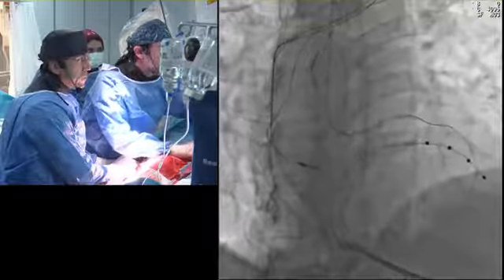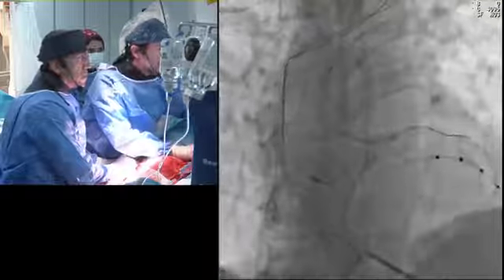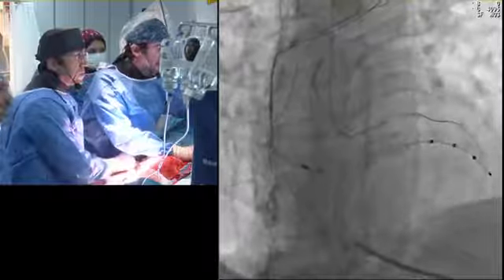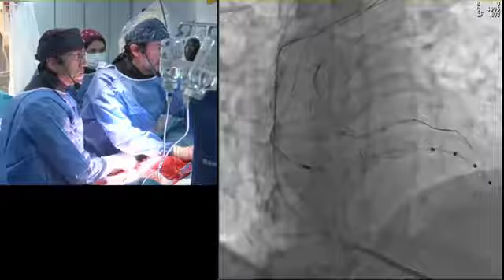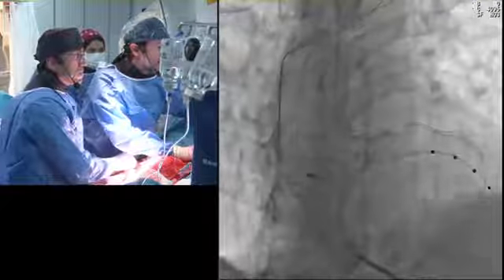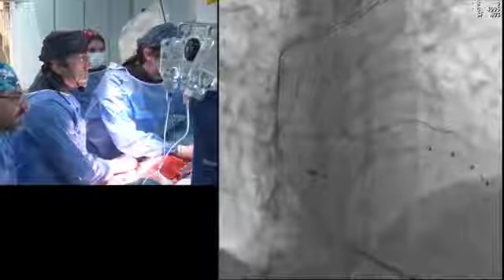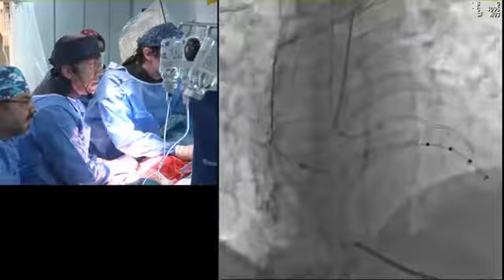The other thing you can do is push the wire all the way to the descending aorta and capture it in the descending aorta. Yeah, this is another option I'm thinking of, but as I said, we have too much friction here. Yeah, I know it's difficult. I will change with the R350. I will take that advice. And the other option is to come back with the micro. I have got it. You got it. I have got it. Yeah.